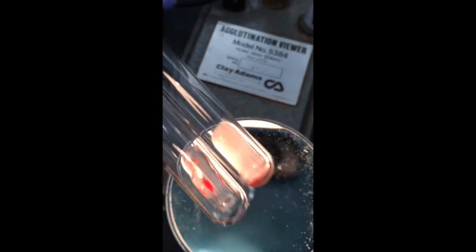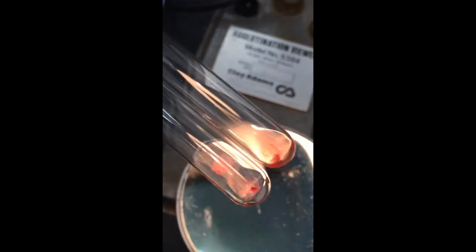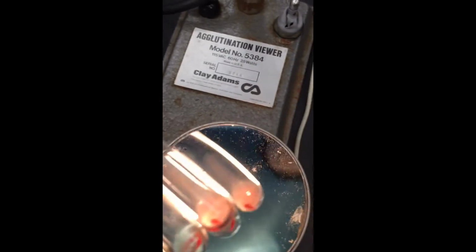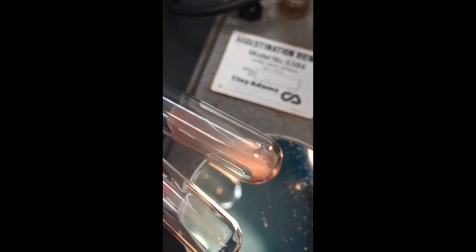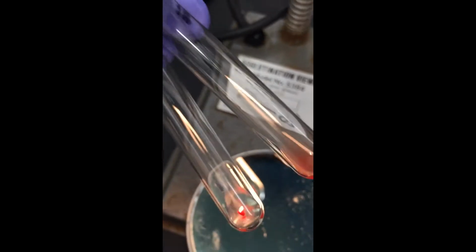Tube 17 and 18. Everybody get that? 18 does not want to come off very well, but very swirling pattern, and it's on the top or the right.